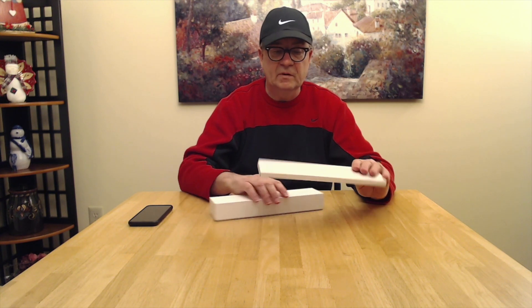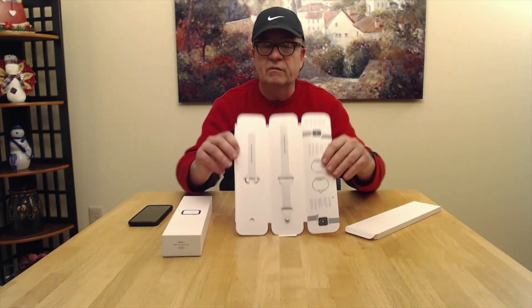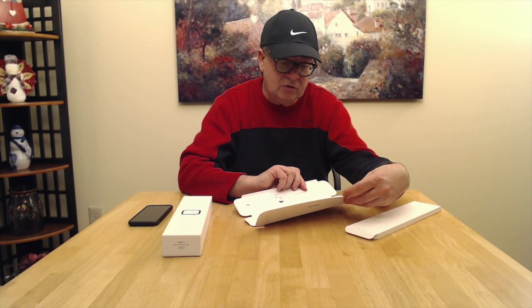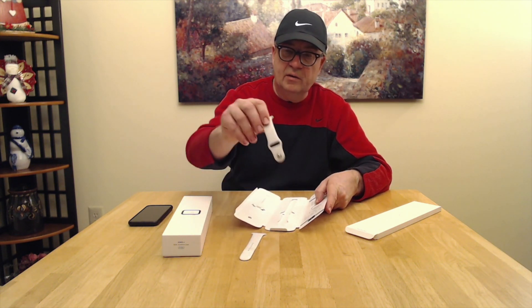Let's put that aside. Inside you get the watch band and the actual watch box. Let's open up the band first. I have the white band. You get two different sizes — one for a bigger wrist and one for a smaller wrist. I need the one for the bigger wrist, so that's the top part and the bottom part.